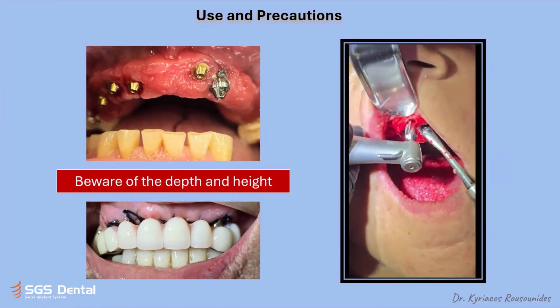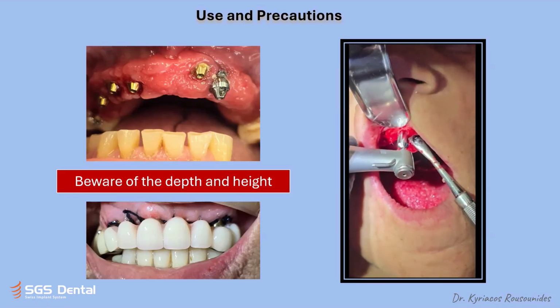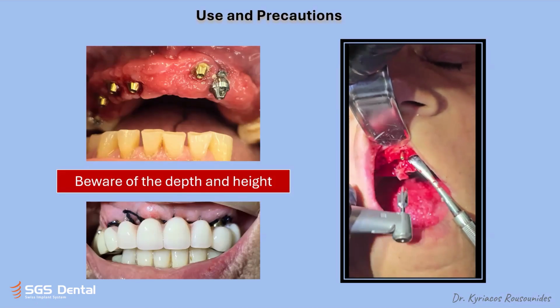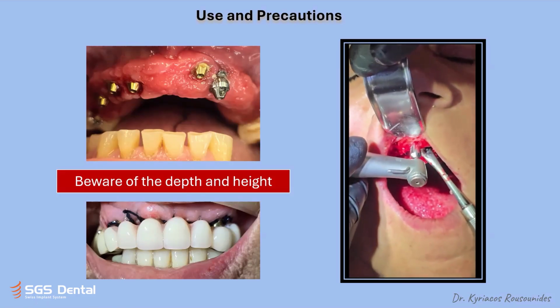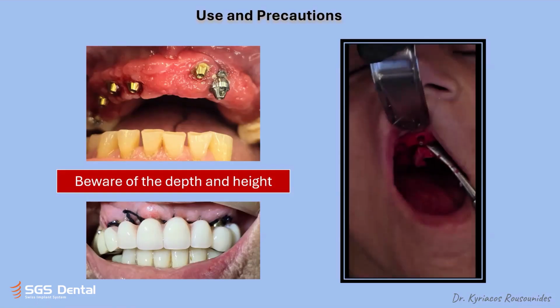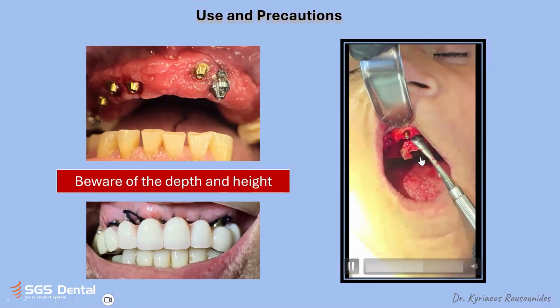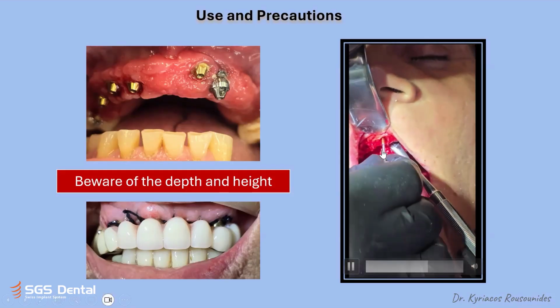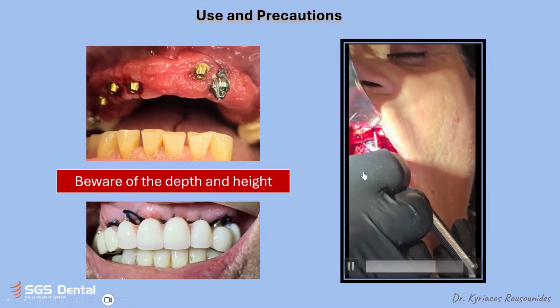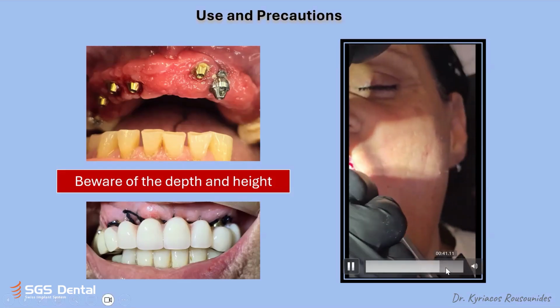We have this drill that is remodeling the bone around the implant, so it can accept the abutment also with a bigger angulation. This part will be removed, and we see now how easily we've done this in the neighbor.